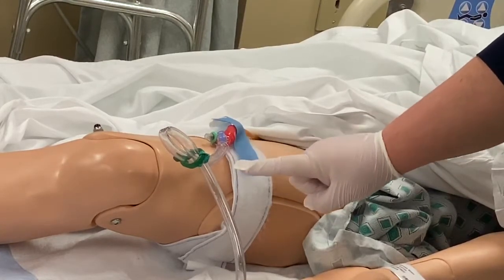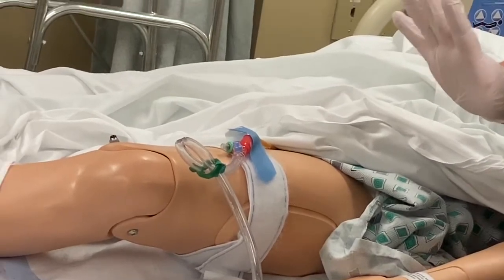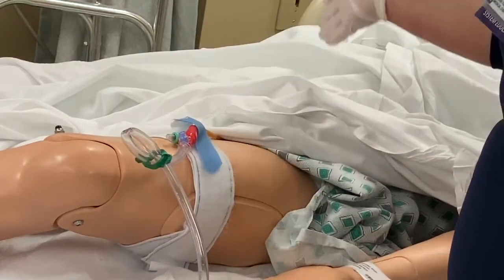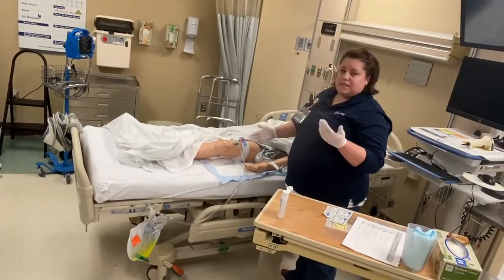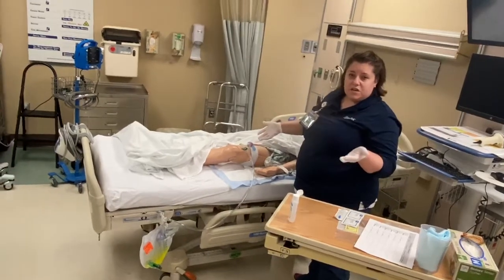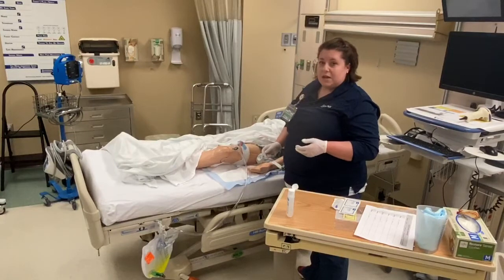Once I do this, I have 10 minutes, no more than 10 minutes to collect my sample. The reason for that is if I go too long, I can cause urine to build up in the bladder, which could cause harm to my patient. Now, if I go 10 minutes and I see urine, that's fabulous. But if it's 5 minutes and I see urine, I can collect it earlier. The max time that I have is the 10 minutes.